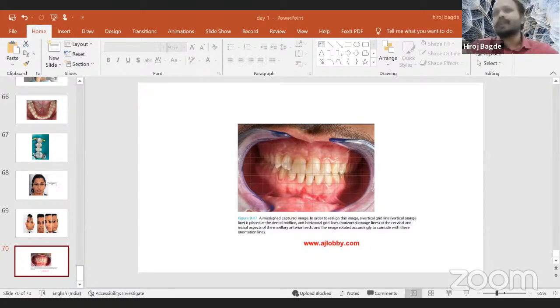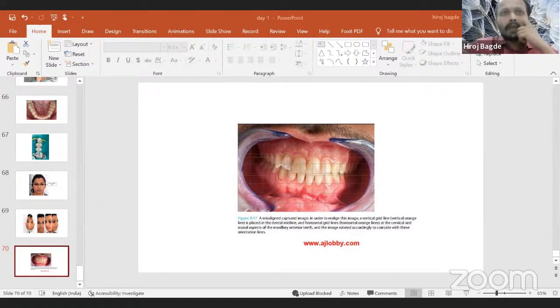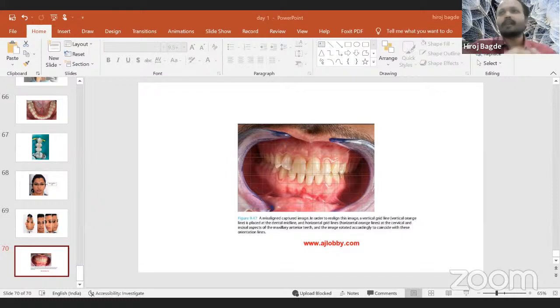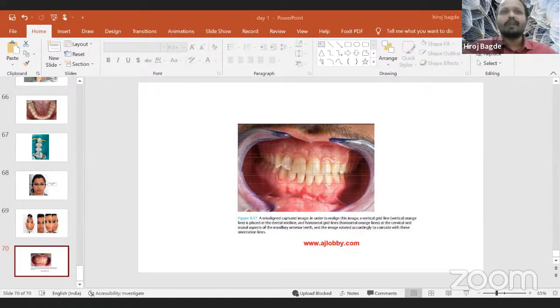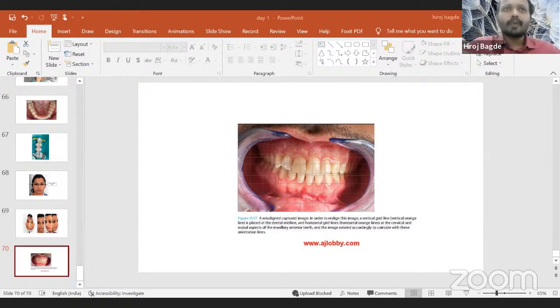For me, we are going to play around with the lights — highlight, shadows, colors. As I cropped the image, there is a change in the histogram. Earlier it was shifting one way; now it has shifted more to the right — we are having more red. Already there is more yellow, more red, and less of blues and greens. So we will have a shift in colors — color temperature. There is a neutral color picker here. It allows you to pick a neutral gray or white part of the photo to remove color cast.